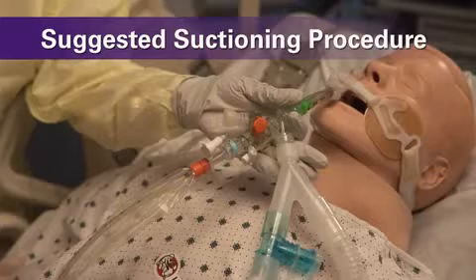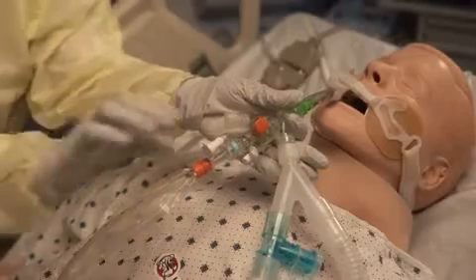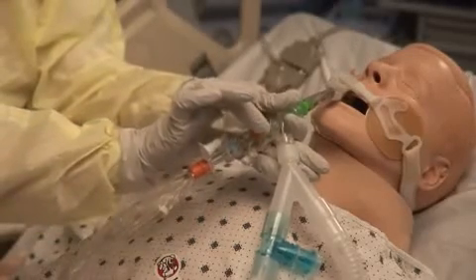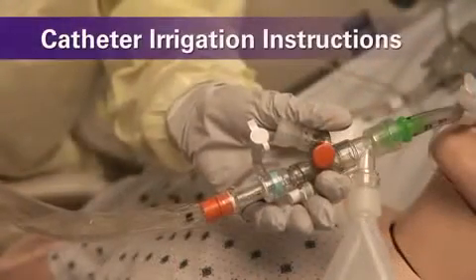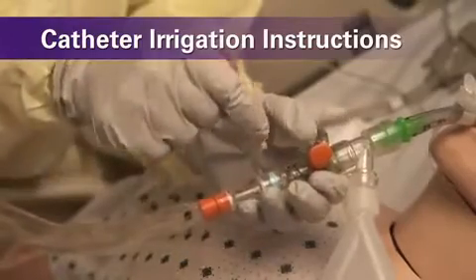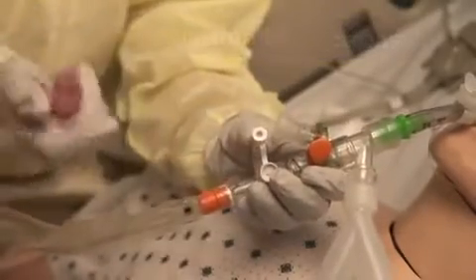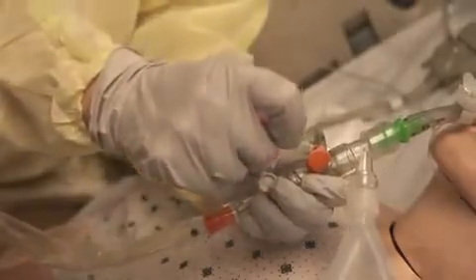Stabilize the catheter in the artificial airway with one hand. Ensure that the catheter is in line with the artificial airway. Depress the plunger button and rotate the KimVent MAP closed suction manifold if necessary. Be sure that the black marking ring is visible inside the sleeve. Open the cap on the irrigation port. Insert the saline vial into the irrigation port.